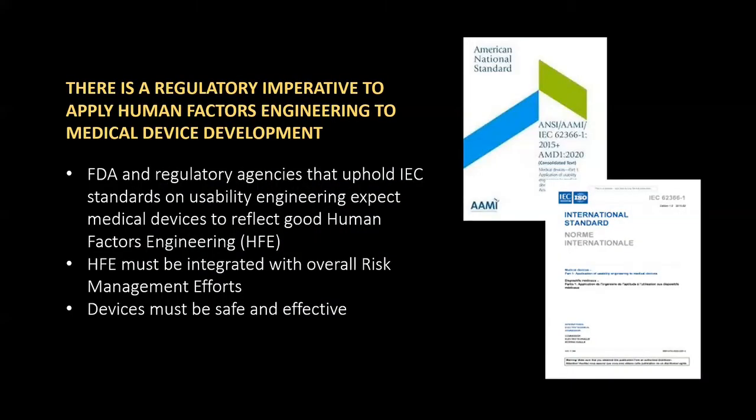There's now a more disciplined regulatory imperative in terms of undertaking this work. Both the FDA and also the IEC have binding standards. The FDA has a number of recommendation papers, they've been formulating that for the last couple of decades.